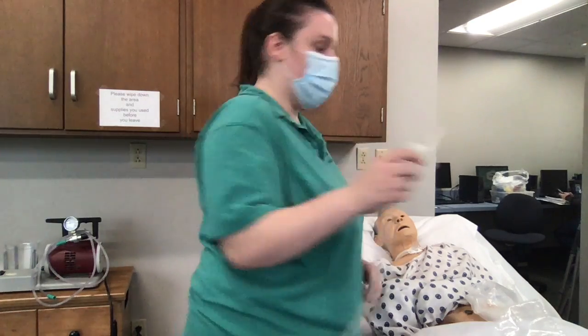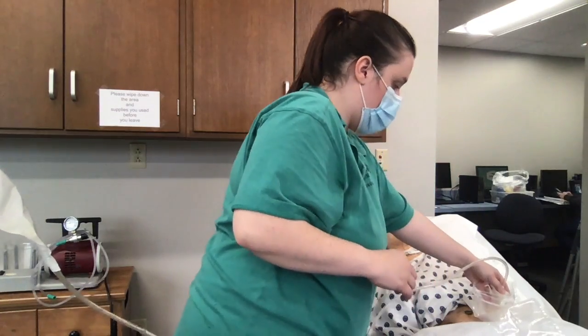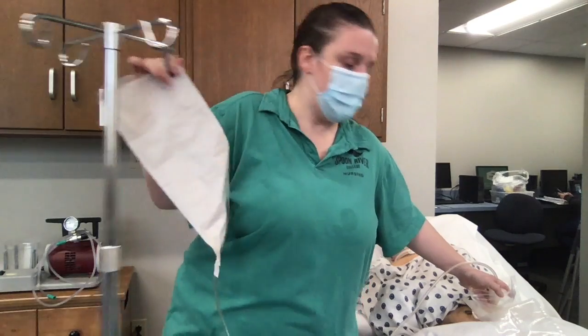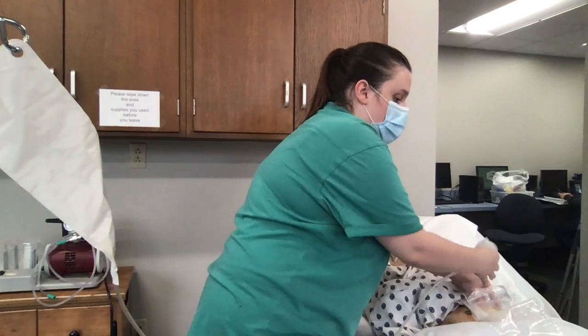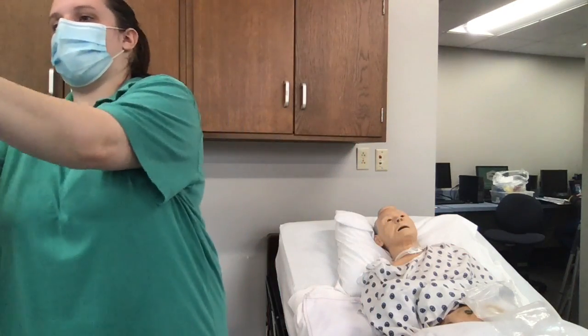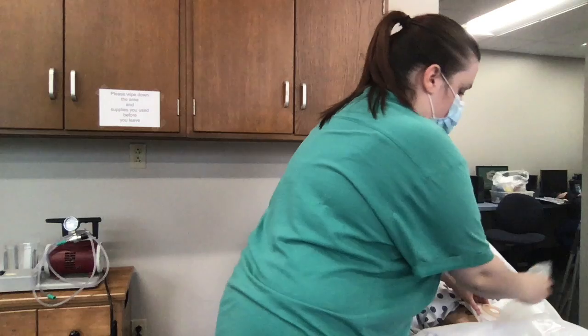And then I'll take my cone and I will place it in the colostomy. Obviously I don't want to push too hard, but then I'm going to make sure that my solution is about 45 centimeters or 18 inches above the stoma. So I'm going to irrigate the colostomy, try to get a bowel movement into my bedpan. And then once that is all completely irrigated, I can be done with this.